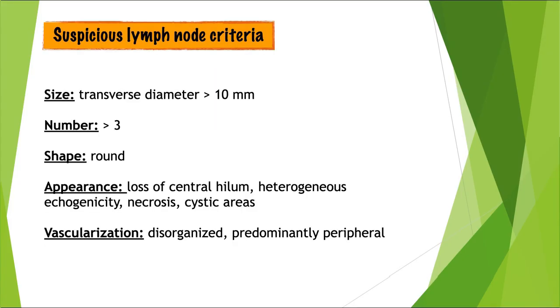So, let's take a look at what we find on the ultrasound. As soon as I placed the probe, the first and largest mass I found was actually this one. Overall, you can see a cluster of multiple heterogeneous hypoechoic masses present in this patient's axillary region. So I thought this clinical case would be an absolutely perfect opportunity for us to review together what the criteria are for suspecting axillary lymphadenopathy.